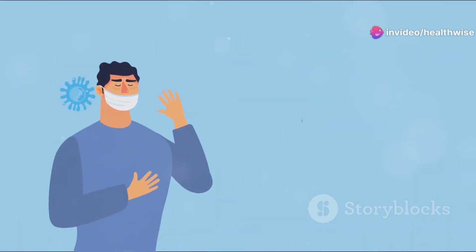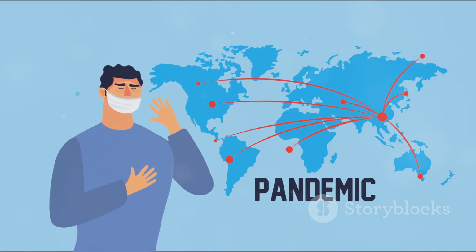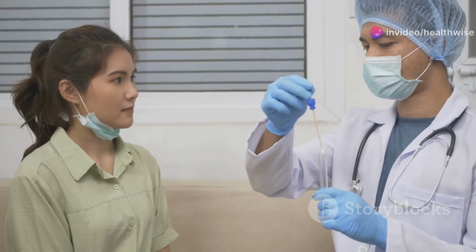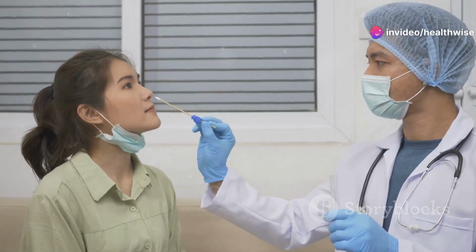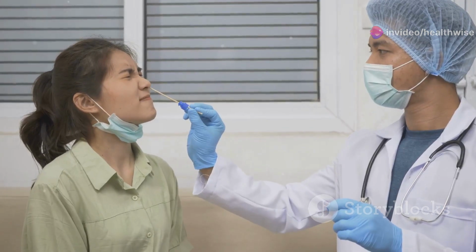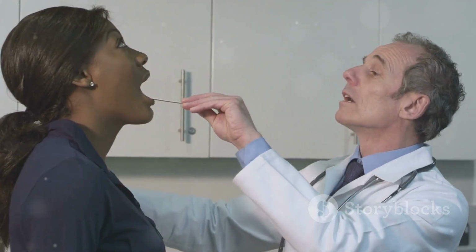Next, instruct your patient to take a deep breath and cough deeply to produce sputum. This might take a few tries, so be patient and encourage them to keep trying. It's important to guide your patient through the process and reassure them if they're having difficulty. The goal here is to get sputum, not saliva. Saliva won't provide the necessary information for a proper diagnosis.